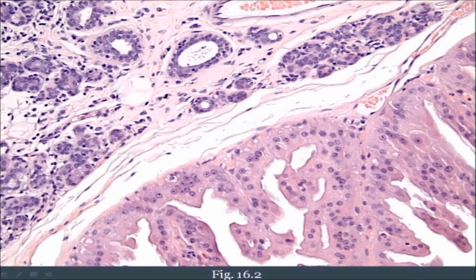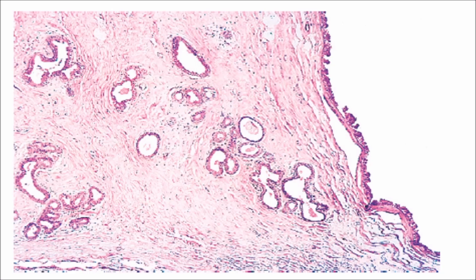In a picture from Pathoma, you can clearly see the abundant pinkish cytoplasm of the metaplastic apocrine cells and the rounded nuclei with small nucleoli. All of these cells lining the cyst are metaplastic apocrine cells. Another picture from Robbins Pathology shows dilated ducts producing micro-cysts, with the large cyst lined by metaplastic apocrine cells.